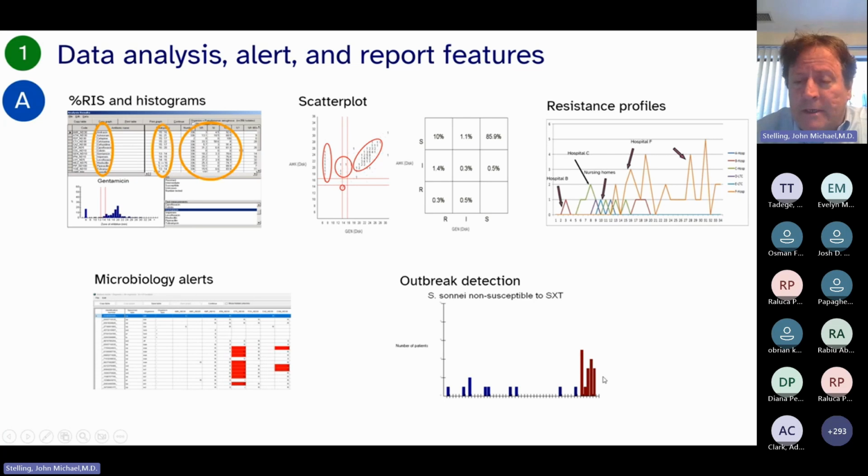These were found in real time. These were confirmed by PFGE, a kind of electrophoresis. A few years later, they were reconfirmed with whole genome sequencing once they had the ability to do sequencing. So with the phenotype, I cannot say that these are the same bacteria, but it does suggest the need for investigation, confirmation, and action.